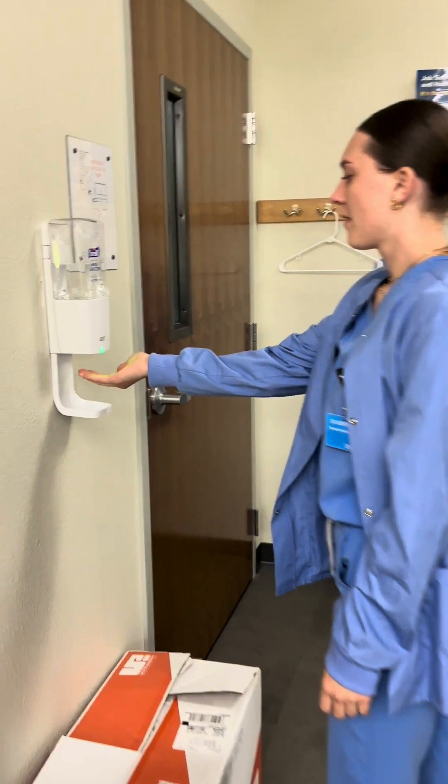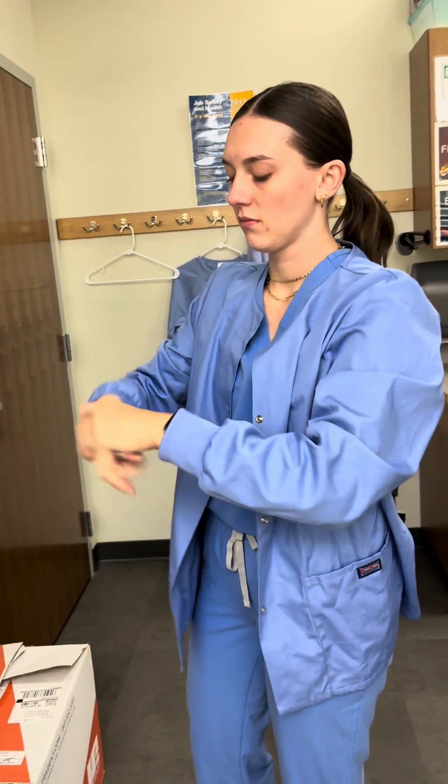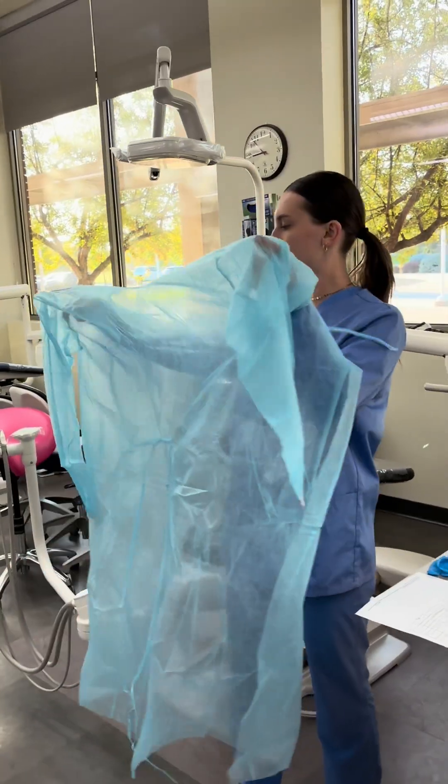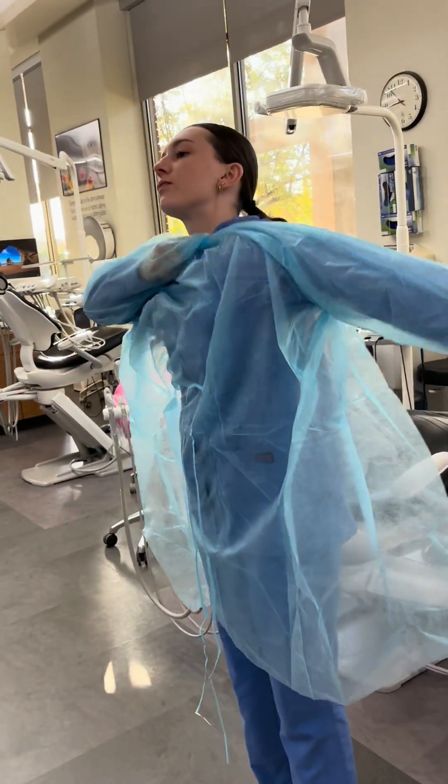Now she's going to get hand rub and dry it really well. Now that hands are done, she's going to put PPE on, starting with the jacket.